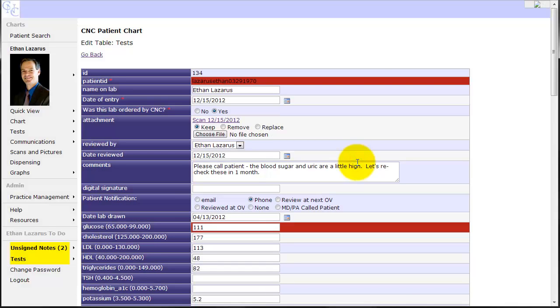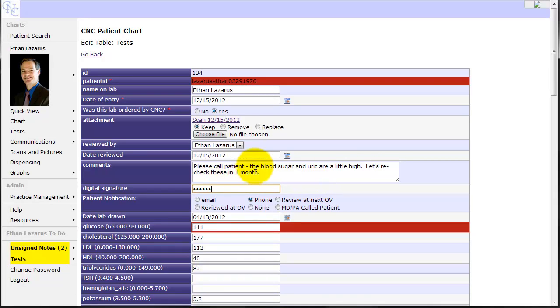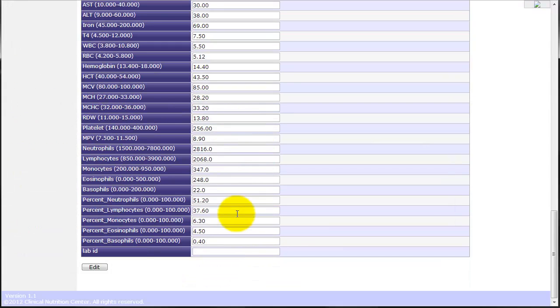Got to go ahead and sign off on it. If I'm going to sign off on it, I need to actually put in my digital signature. So there's my digital signature and I'll sign off.